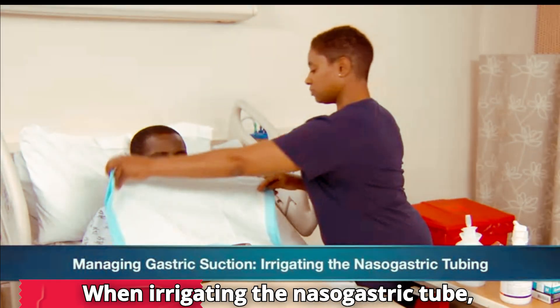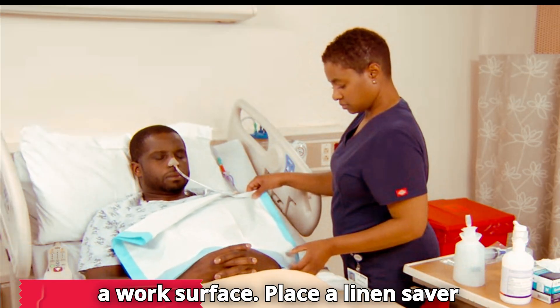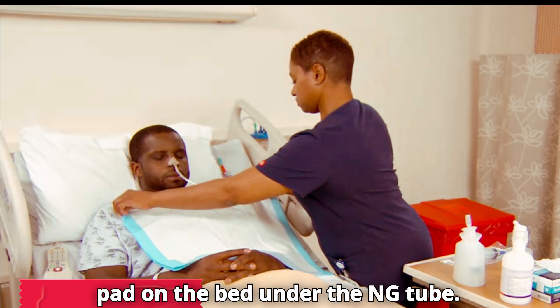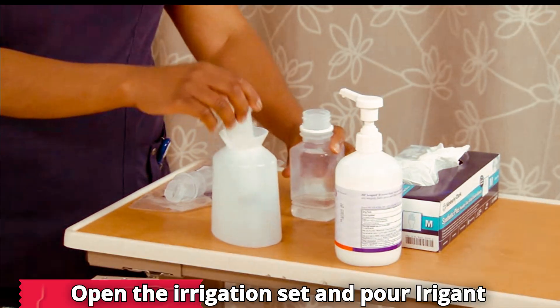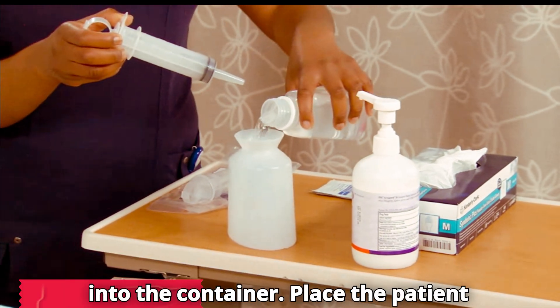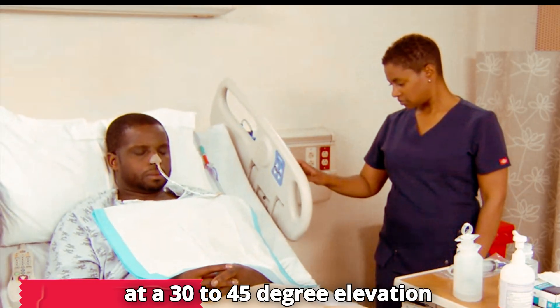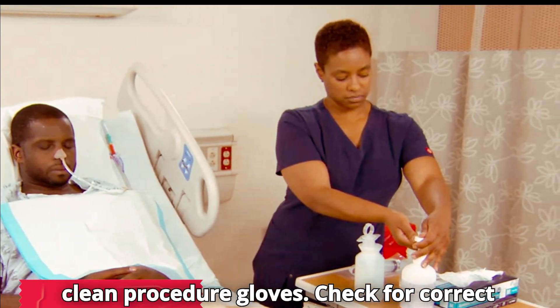When irrigating the nasogastric tube, follow these steps. Cleanse or cover a work surface. Place a linen saver pad on the bed under the NG tube. Open the irrigation set and pour irrigant into the container. Place the patient at a 30 to 45 degree elevation if not contraindicated. Don clean procedure gloves.